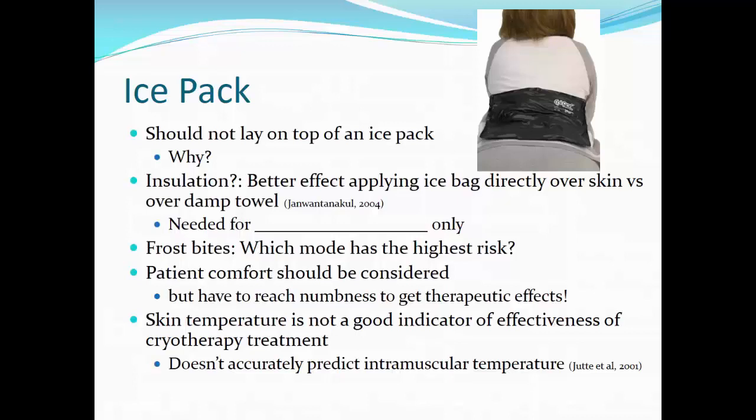Again, reusable cold gel packs should not contact the skin. There is a potential that the body weight could puncture the reusable pack and may cause it to leak. In addition, patients sometimes have a difficult time moving if they're in pain, and therefore if the pack starts leaking, an injured patient may not be able to move quickly enough to remove the leaking ice pack.